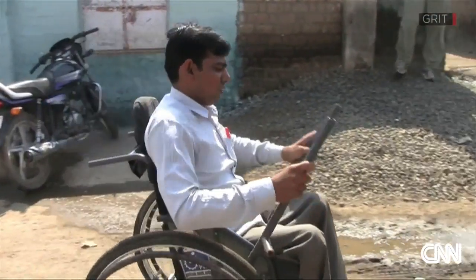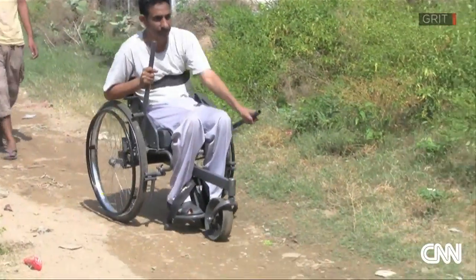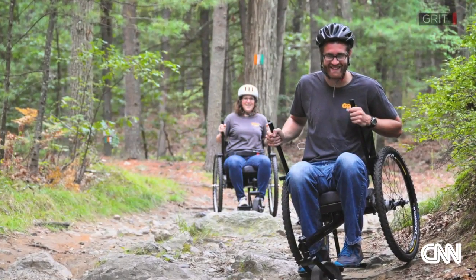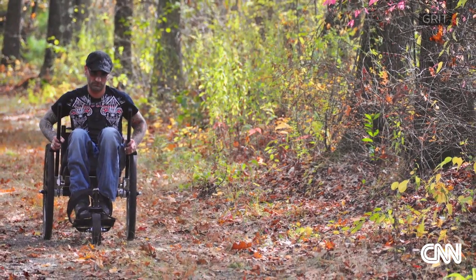The Leverage Freedom Chair is now in production in India, a place from which it can be easily and cheaply shipped to countries that most need it. But Winter developed a new built-in-America version after learning people with disabilities in the U.S. wanted a more robust chair, too.